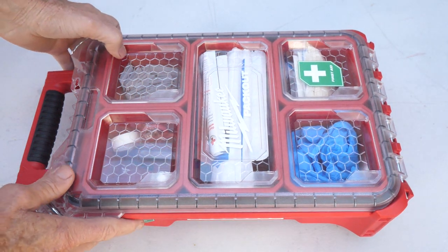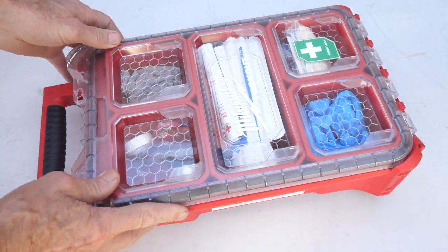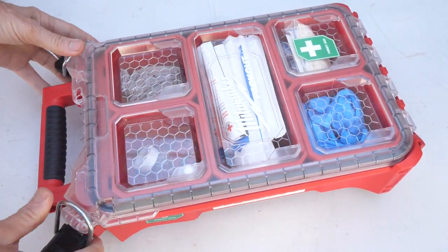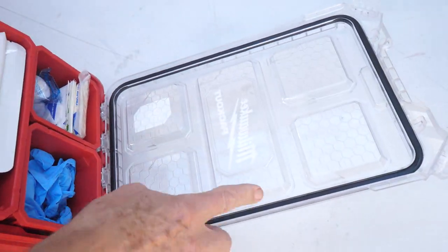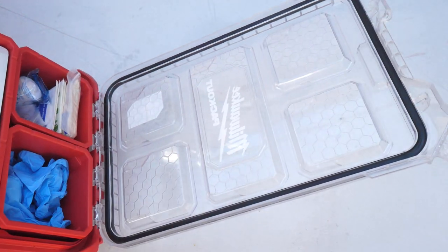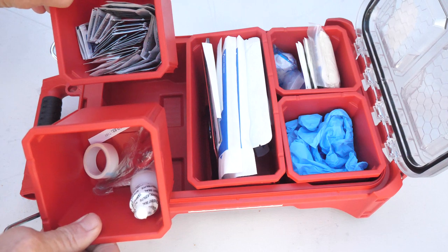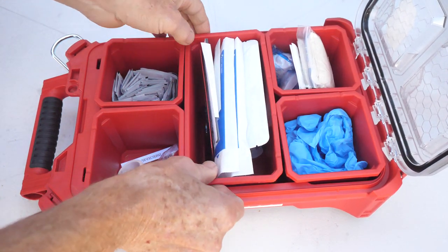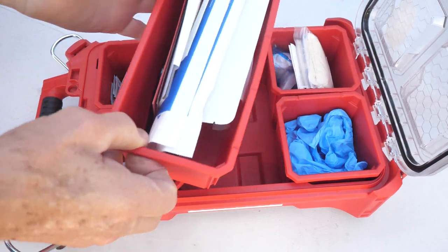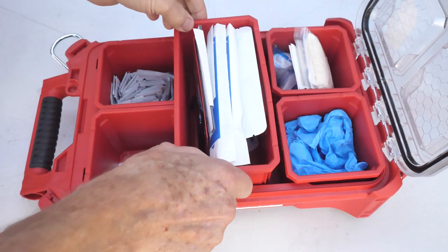Being IP65 rated means it's pretty difficult for water to get in here — it's sealed up quite nicely. There's a rubber seal all the way around and a couple of latches. Notice that there are actually five individual containers in here, so in an emergency you can grab one and go directly to the emergency site to help out your fellow worker.